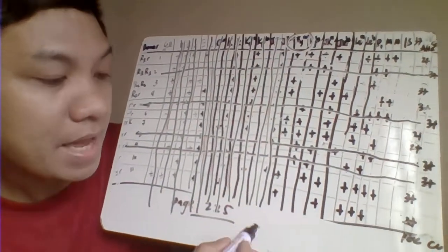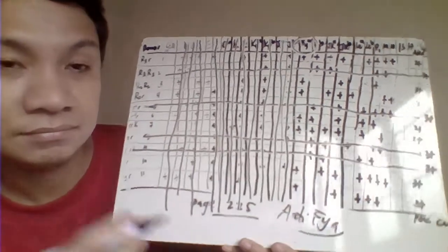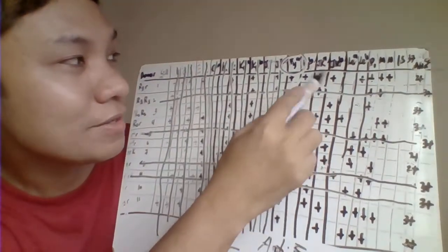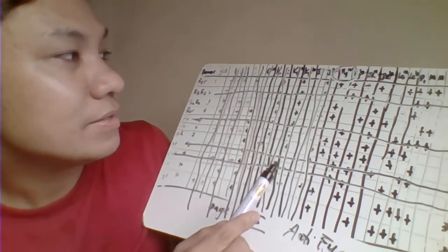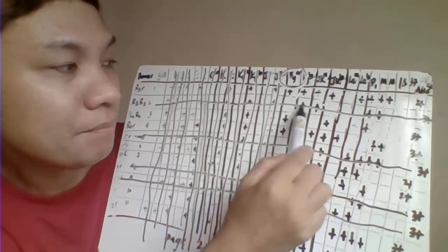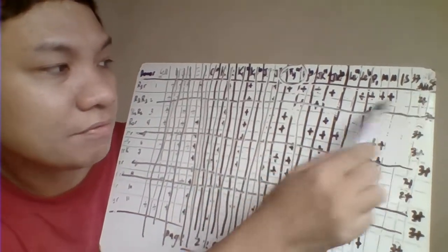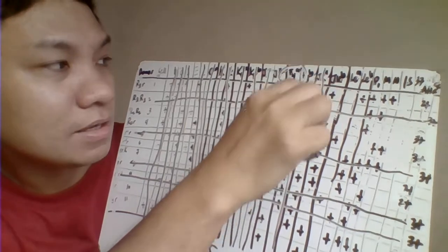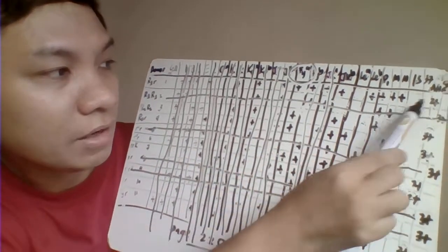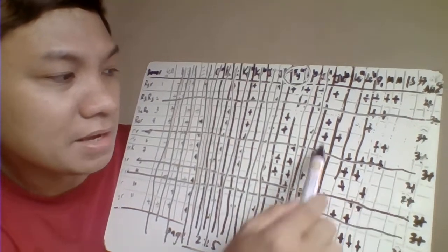So, mean to say your patient has FYA. So, next na natin ang sunod, KP. Okay, that's your FYB. Positive. Positive siya. Ay, sorry, hindi na siya agad. Okay, dito positive. Dapat dito ay negative. Ay, hindi din ito. Okay, positive. Negative. Positive. Positive. Ay, negative.